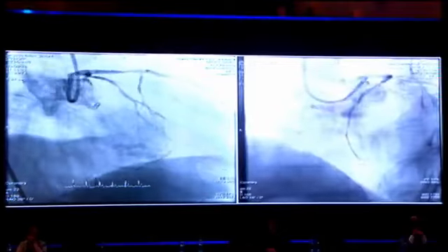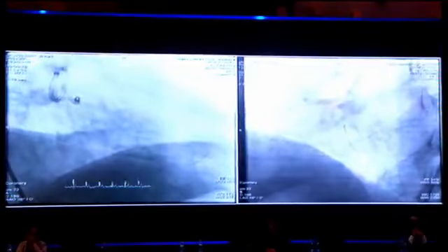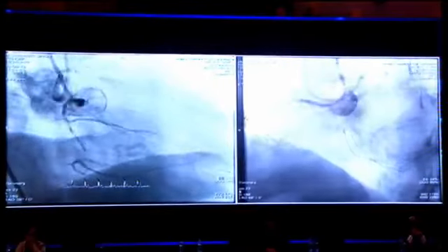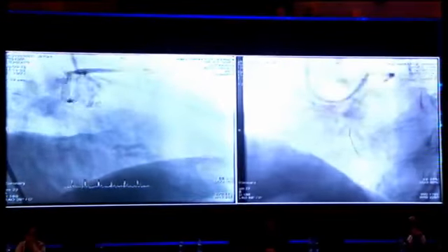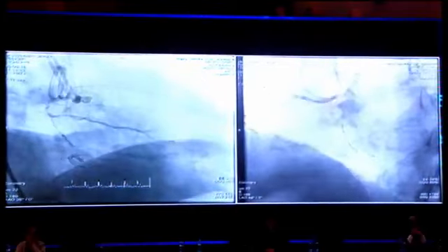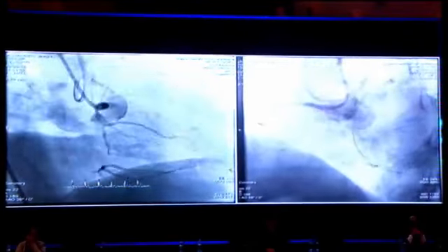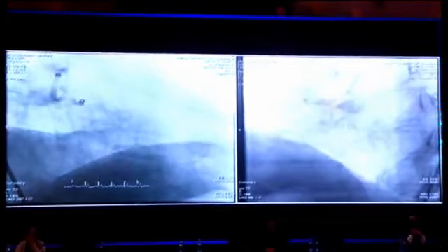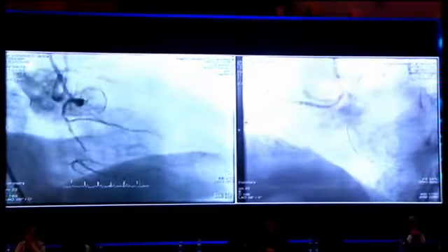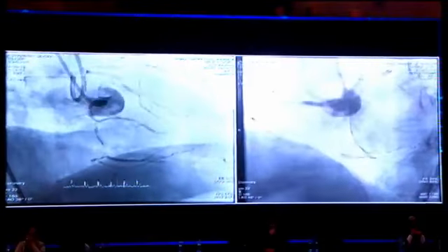Yeah, but what you have to consider with the antegrade approach here is that it is a flush occlusion at the crux. And if you only go a little bit subintimal, you may lose one of the branches, which is not what we want. We want to save the whole system. So that is the consideration why, in such a rather easy lesion, tapered and so, we should keep retrograde very first on our list. Okay, we do agree, because there are the large PDA and PLV branches and the flush cutoff just at the origin of both.